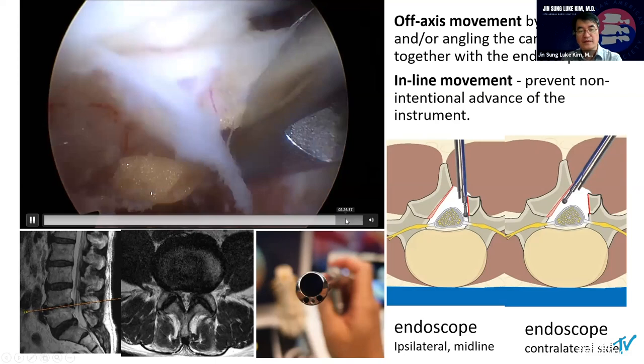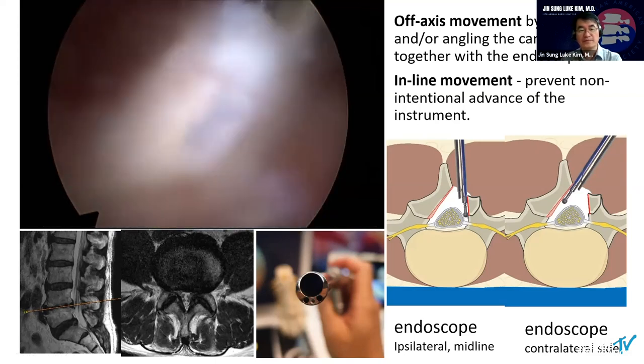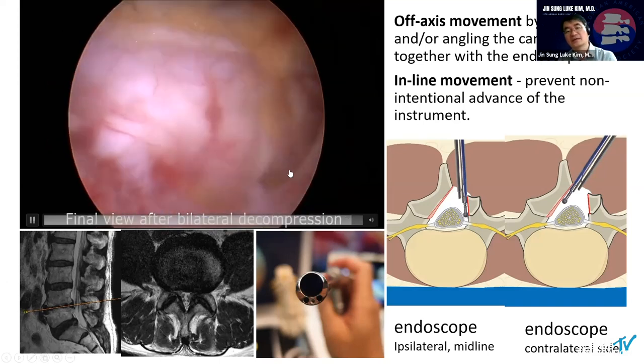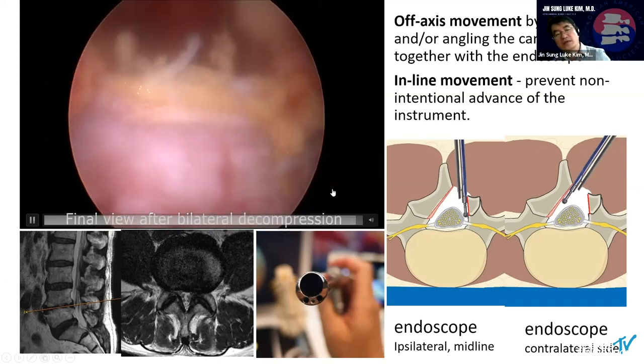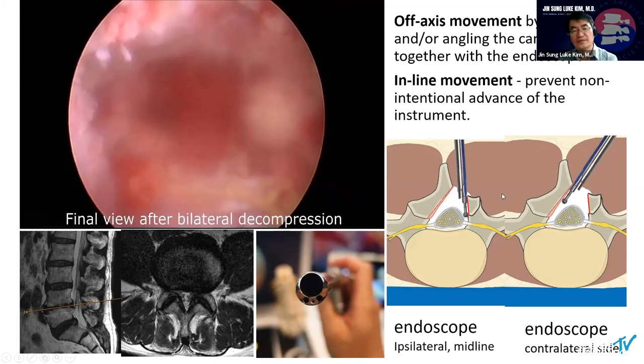After removal, detaching all the way of the ligamentum flavum, we can decompress the canal after the en-bloc resection of the ligamentum flavum. I love to remove the ligamentum flavum in an en-bloc fashion.